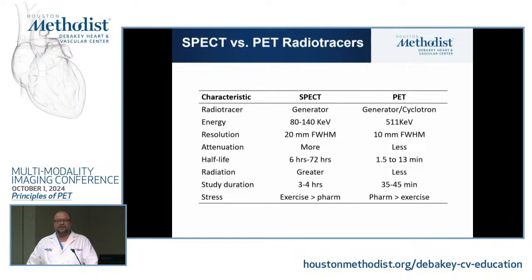And obviously the study duration, for those of you who work on it, you can tell that. If you're doing rest-stress SPECT versus a complete PET scan, it's very different.